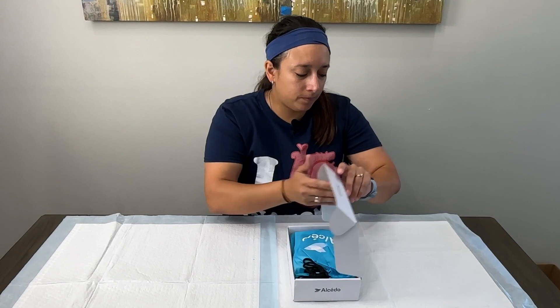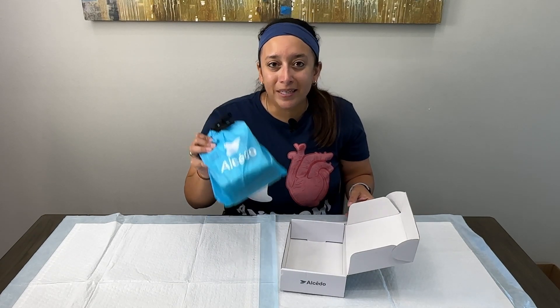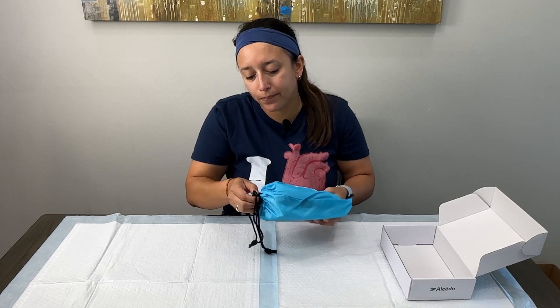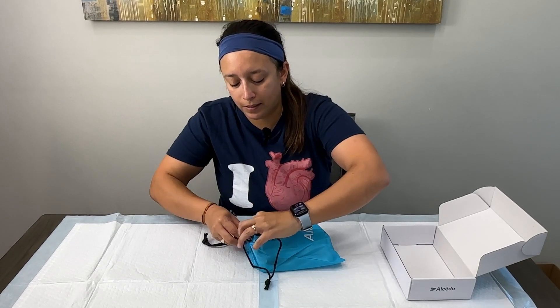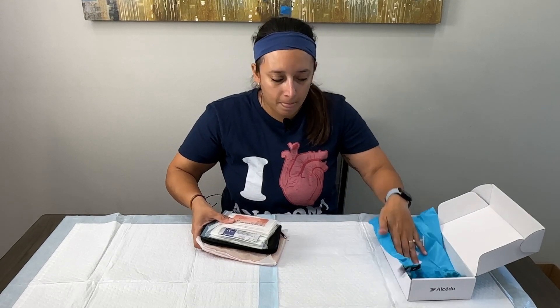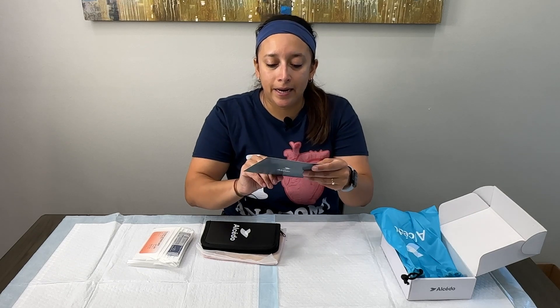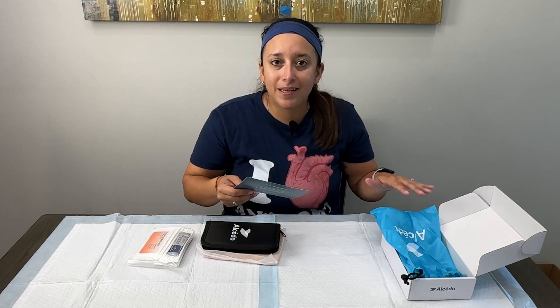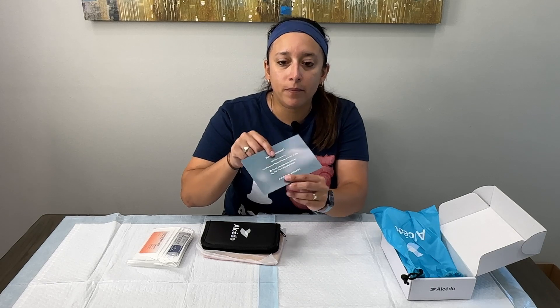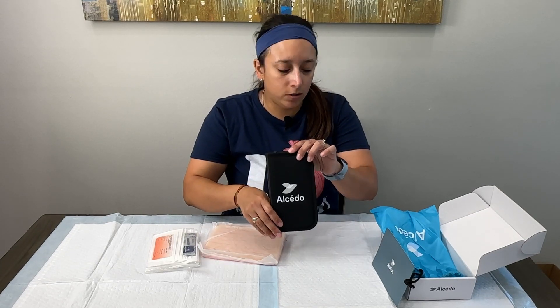It comes neatly in a box, so we're going to go ahead and open that up. Inside, they include a little bag to carry everything in, which I really like about this kit. Also, they have a support phone number — I've contacted them before and they are really receptive and responsive, so if you have any problems you can call their toll-free number or send an email and they'll help you out.